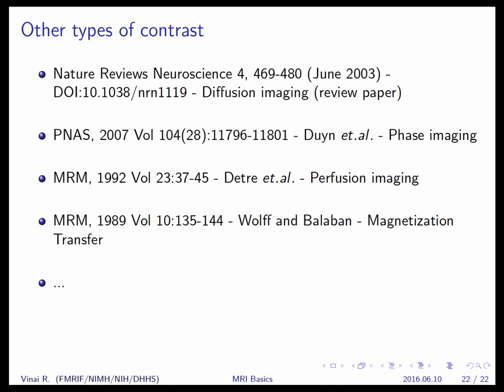Yeah, Nicole. Anyway, sorry. The way I've seen this before is that the data comes out of the scanner in K-space, and then the Fourier transform turns the information in K-space into image space, basically.